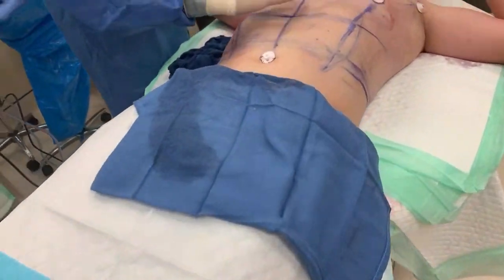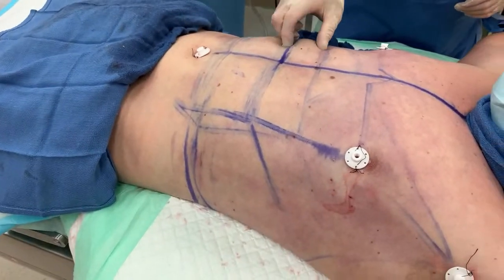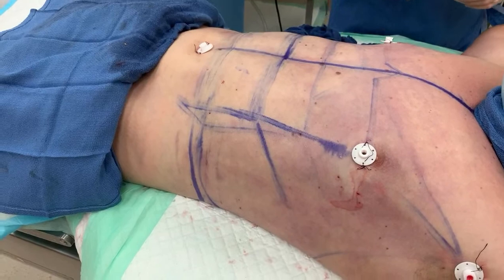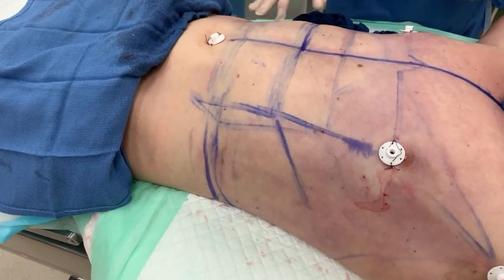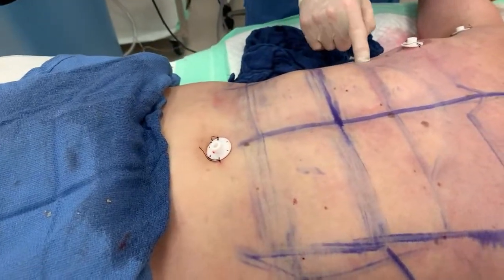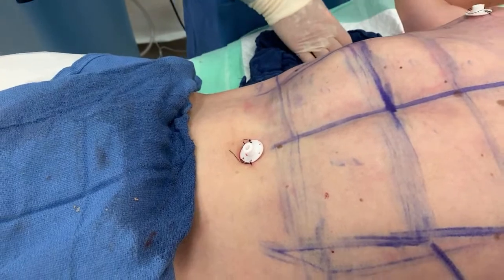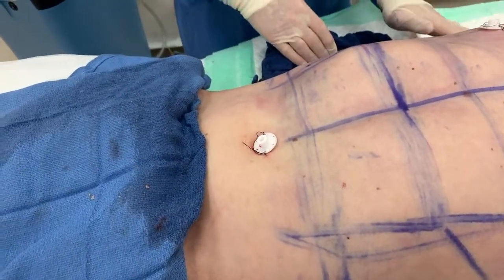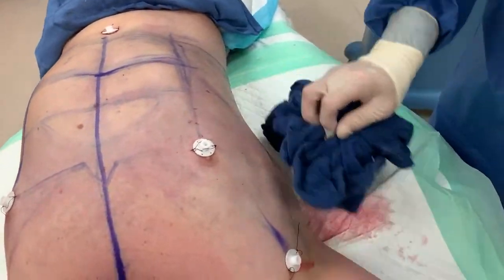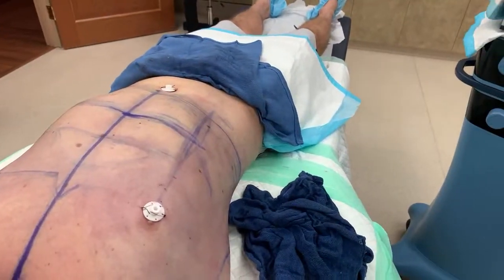Let's see the muscle here — see the lats? Make a muscle, lift up here, a little bit of your lats. Can you see it? See the lats? Shaped there — nice, beautiful. Look at that, excellent! Someone wants to know what it feels like. It feels like a massage — like a deep tissue massage. What is it feeling? Nothing really — this is having fun.